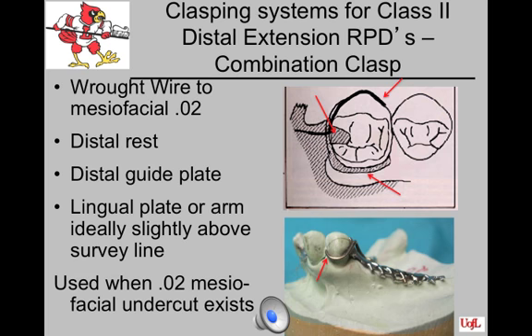One of the wrought wire's shortcomings is that it gets out of position easily as the patient uses the clasp for repeated insertion and removal of the prosthesis. The indication for use of this clasp is when you have an extension base area on your design and you want a clasp that is flexible because of anticipated movement of the base under function.